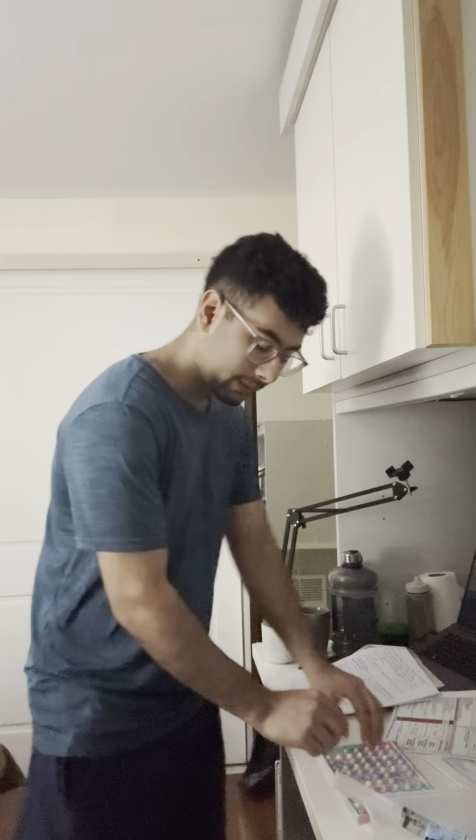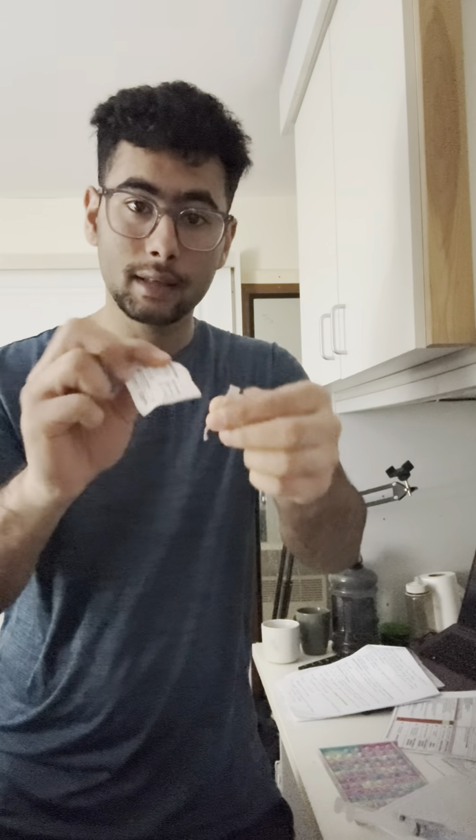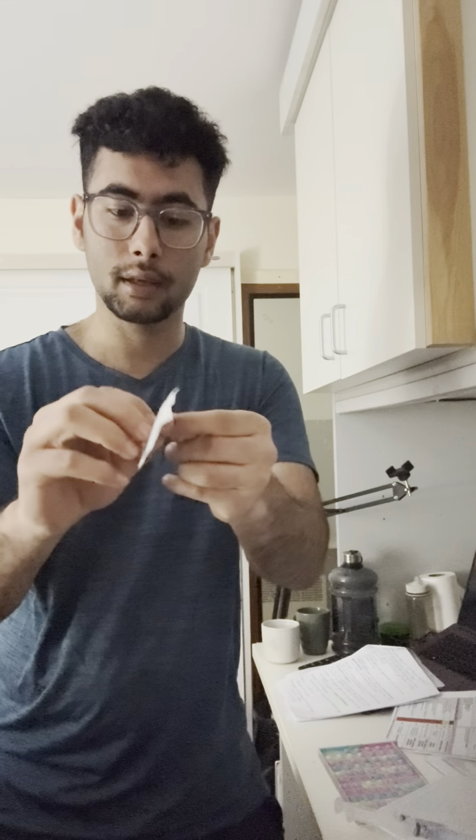Now we're going to tell her. So we are going to give this antibiotics. Are you okay? Are you ready? Okay, she's ready. Now we're going to take out the cannula. There is a cap on the cannula. Take out the cannula. Get your alcohol swab. Clean this using that alcohol swab. So this is the alcohol swab. Take it out like this, the way I'm taking it out. This is an actual alcohol swab, right?